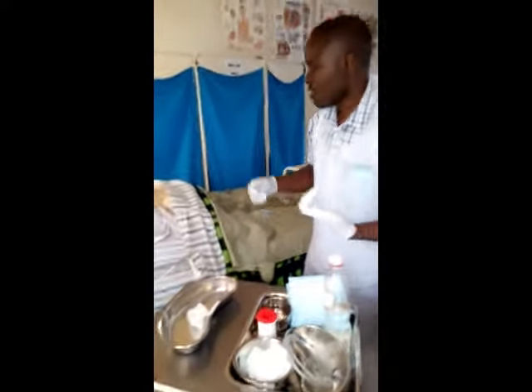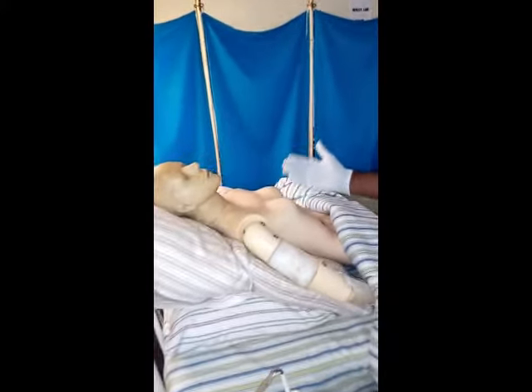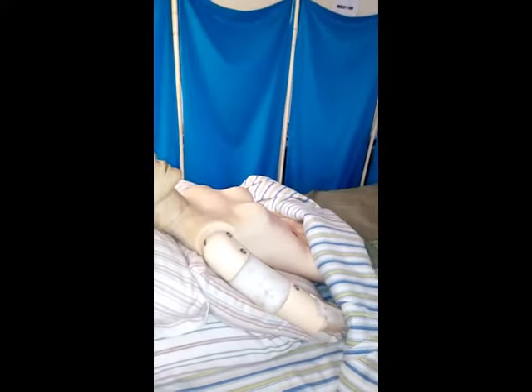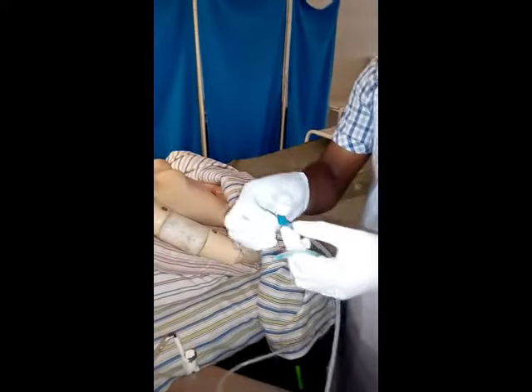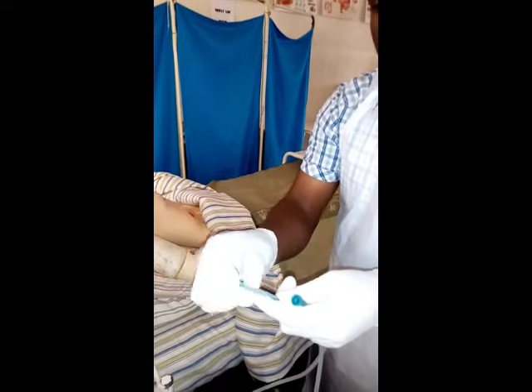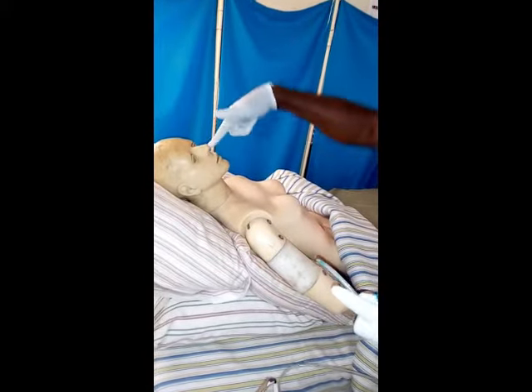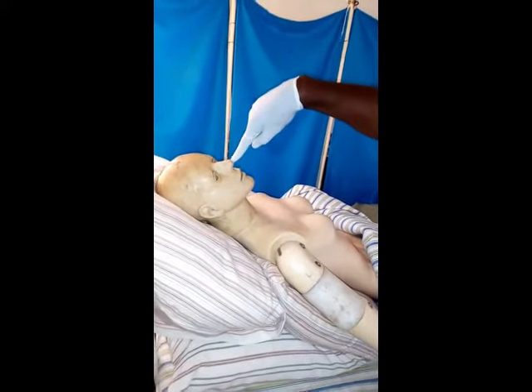That's the critical part for measuring the length of the nasogastric tube. So Mrs. Mwape, I'm exposing this part to your chest so that I measure nicely the nasogastric tube that will be inserted. So you get the nasogastric tube. As we earlier on said, this is a spigot, so the spigot has to be there. So meaning the part that goes into the patient's stomach is this part. So this part has to go on the tip of the nose. So this is the tip of the nose, okay? So this is the tip.